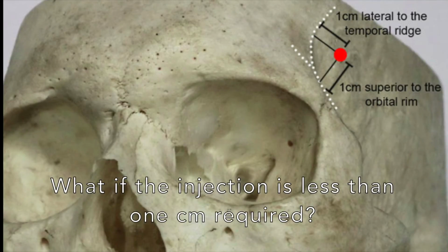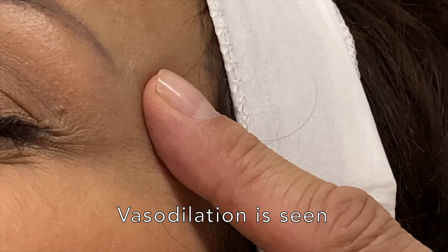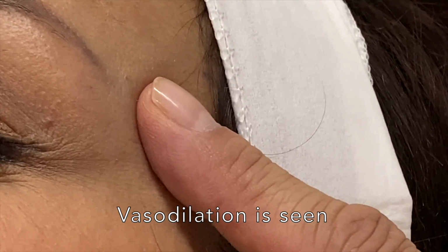What happens if the injection is less than 1 cm? Remember that the filler is trapped between the subfascia and the bone, even though it is in the temporalis muscle. The patient may feel a sensation of pressure or headache. In an actual case recorded, the patient complained of pressure after the needle was withdrawn.